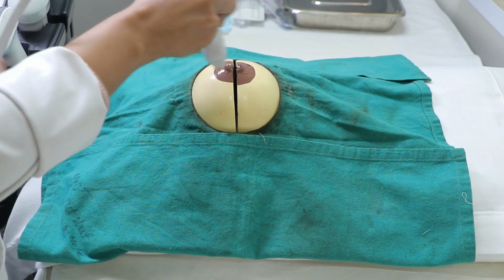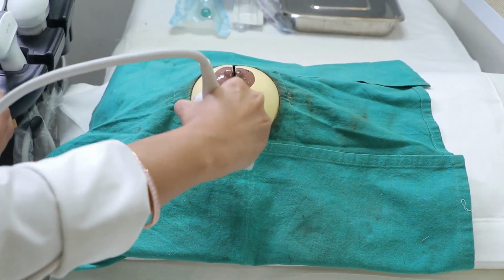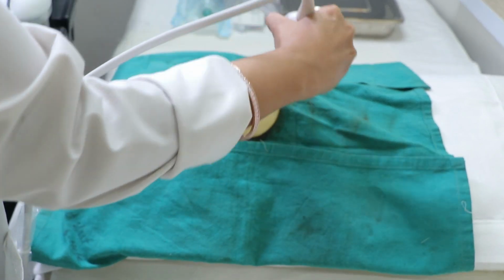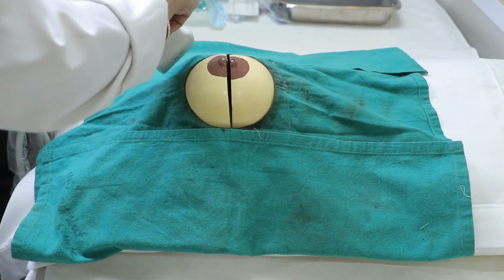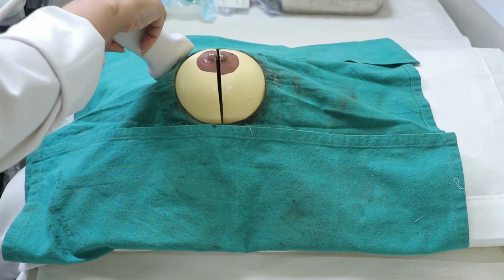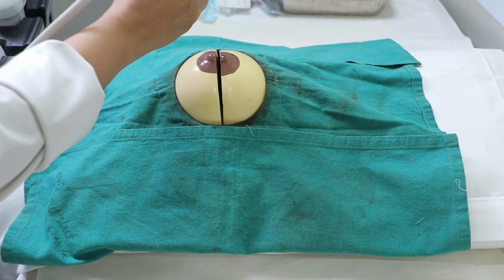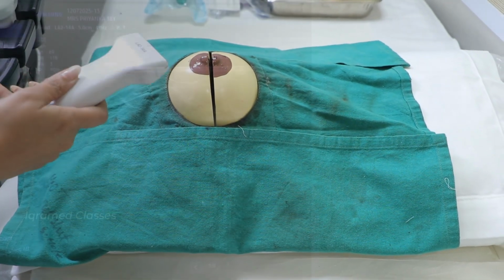Transverse we are going to do from top to bottom. Longitudinal we are going to do from lateral to medial or medial to lateral. Then we will also cover the axilla in an oblique position. This will cover the axillary tail and the whole of the breast. So these are the probe movements which you should know how to do.